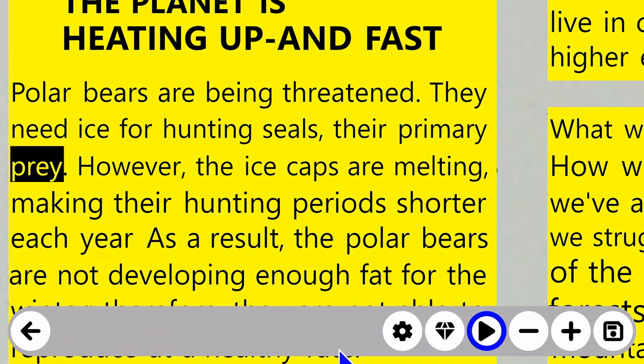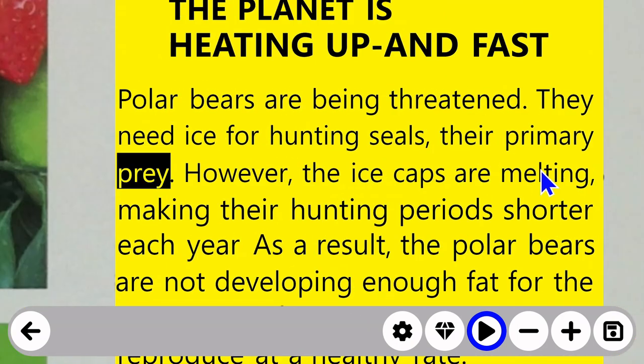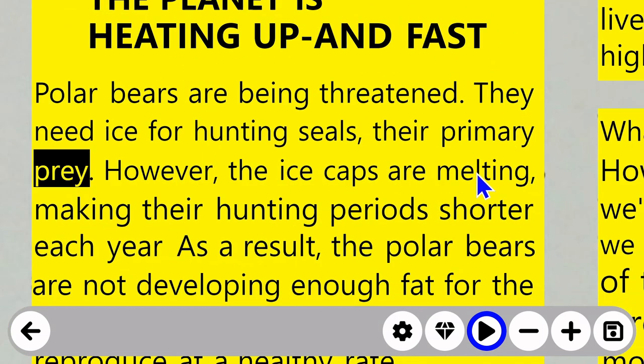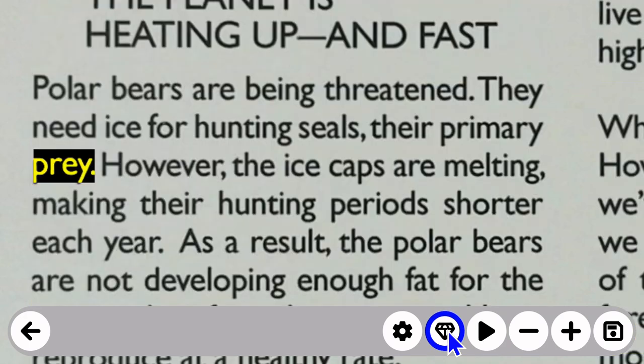You probably noticed that my toolbar, when I started reading, dropped down and it left a tab in the center of the screen. I simply clicked on that to bring it back so that I could pause again. Of course, once we've captured a document, I can click and drag to move it around. I'm using the wheel on my mouse to zoom in and zoom out right now. You have your plus and minus signs in the lower right corner there to zoom in and zoom out. And then to the left of that lit up play button is our diamond edge option.